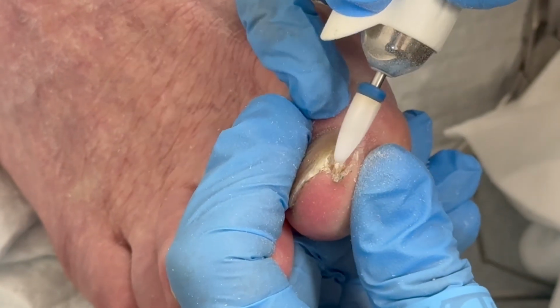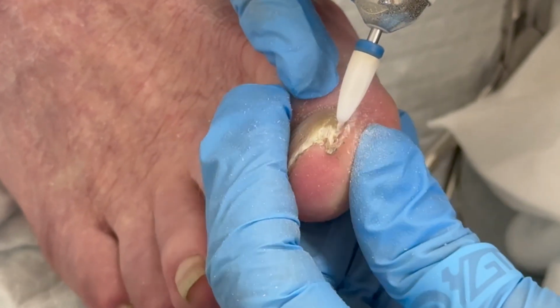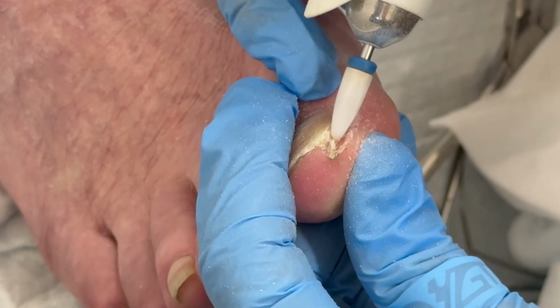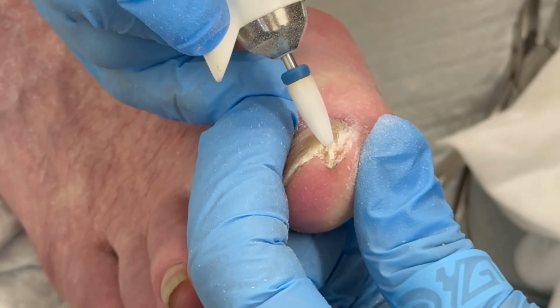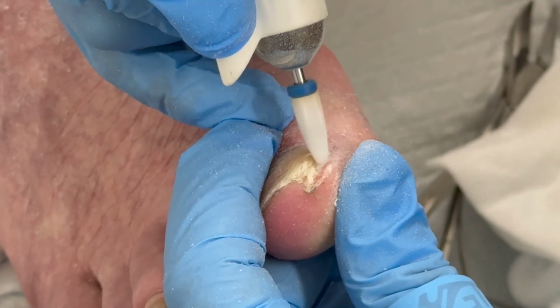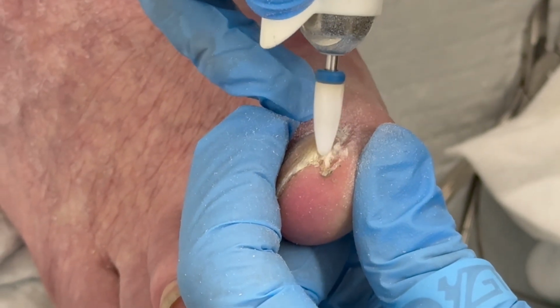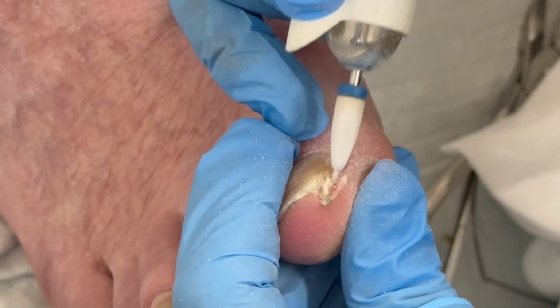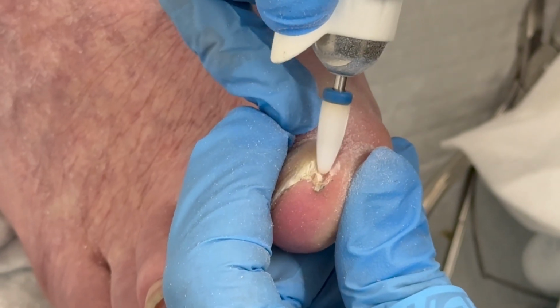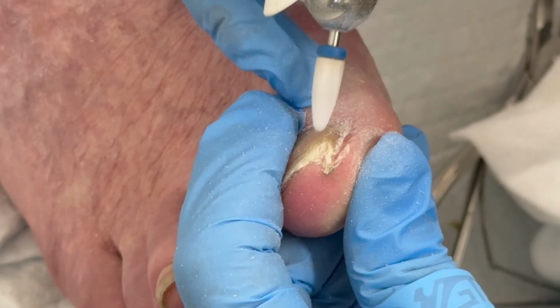Okay. Now, if you can see in there, is this tender up there? A little bit, but it's okay. Okay, so what I'm going to do, I'm going to get a little bit more thin in this thick area here. And where it's thicker, you can press heavier. Where it's thin, you go very light, kind of feather light. But down there at the very side of the nail, I want to get in there and clean that out.